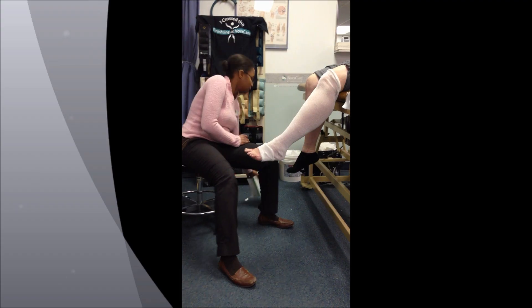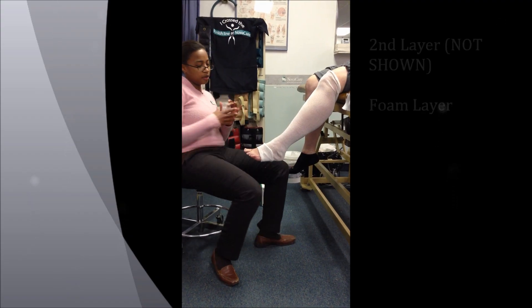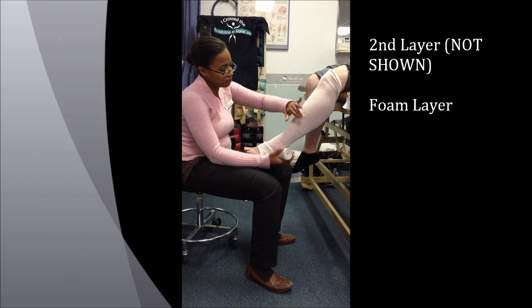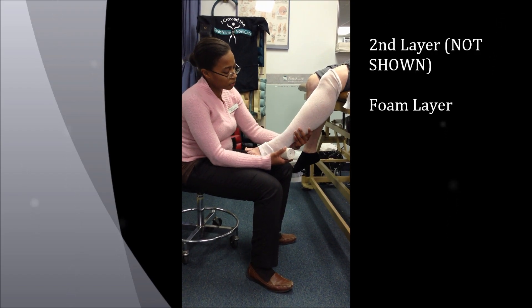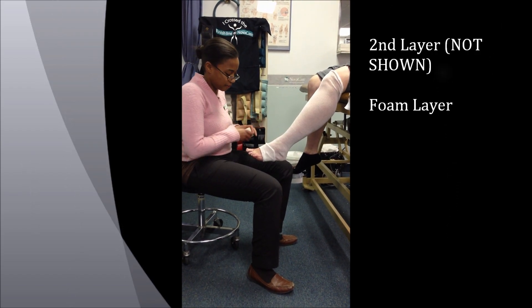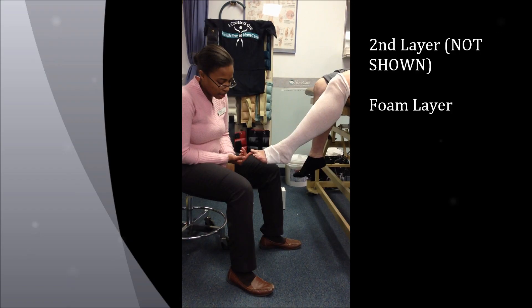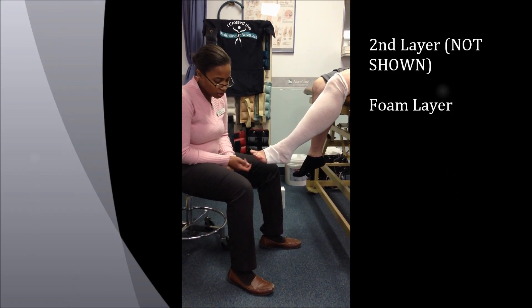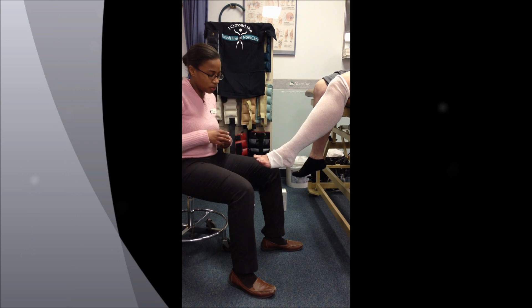Usually you would have foams on the side and foams on top, so you would have to wrap the toes on the top and in the back, and that is covered with an isoband. But for this video, we will not. Also for this video — and not everyone would need it — we would sometimes wrap the toes as well. Again, for this video, we will not.